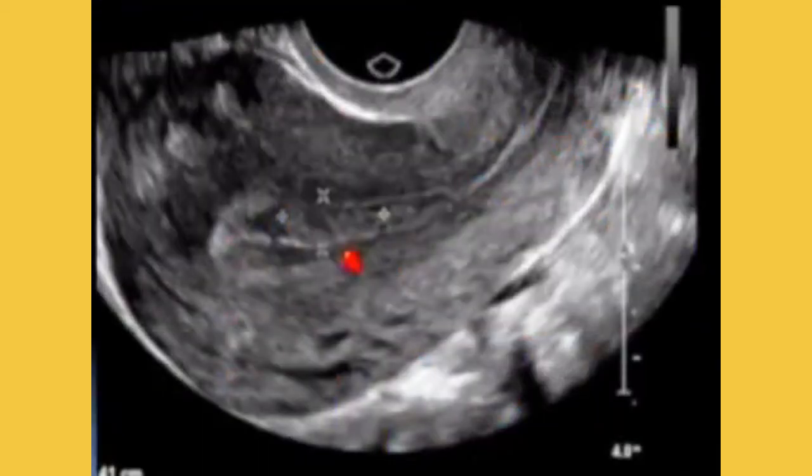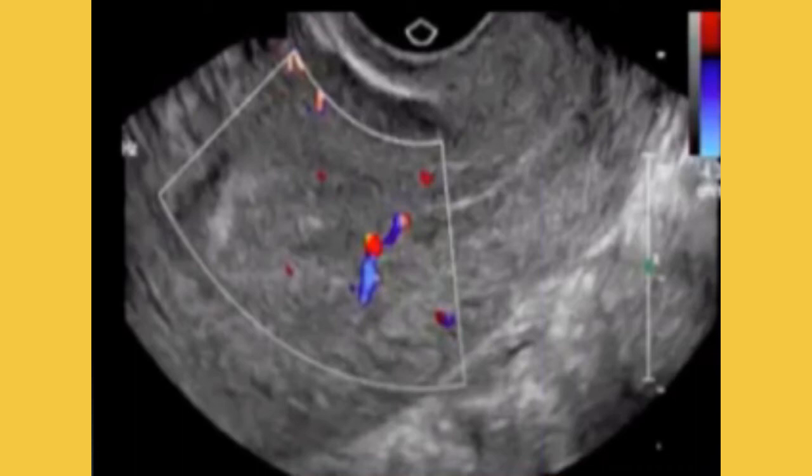Similarly, in this case, the appearance is more of a polyp, but when I saw the earlier scan just before the pregnancy, there was no polyp, and actually it turned out to be a small RPOC. So it is mandatory to see all the previous papers as well as the clinical perspective. In this case, we were neither seeing the thickened endometrial echo complex nor the intracavitary mass, just a small vascularity. But the patient was bleeding continuously, and this was a very, very small RPOC because we were seeing the vascularity here, and the patient had treatment and she has recovered finally.